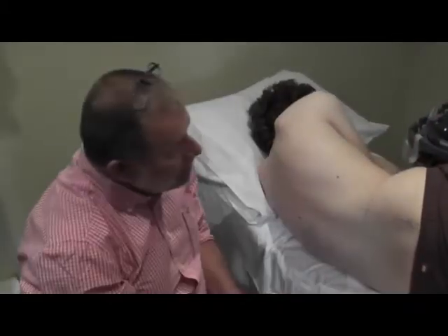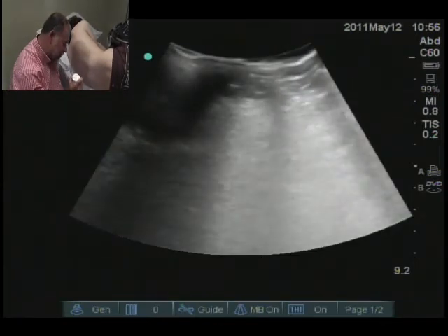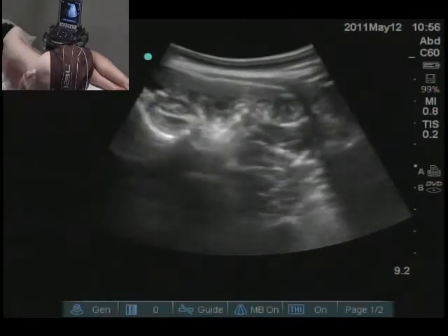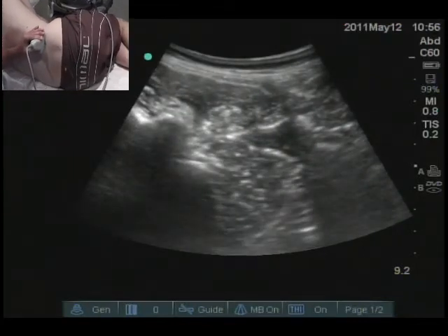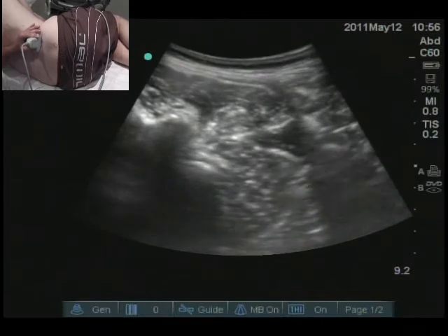So what we're going to do is we're going to have a look at the lumbar area. There's our classical. What we'll do is we'll just quickly put our probe, a bit cold, over where we're going to do it. Okay, so there we are. So we're over where we want to be. We're doing it. And does that show us anything reasonable? Well, it doesn't show us anything too bad.